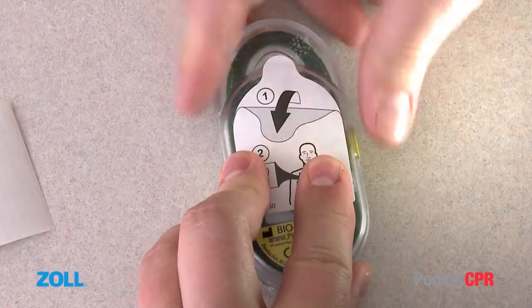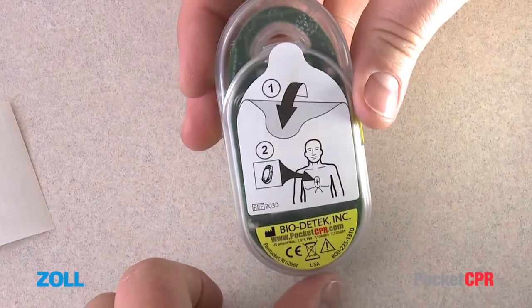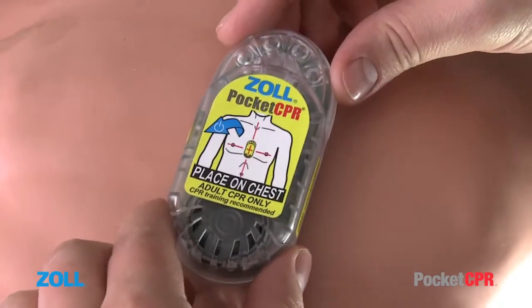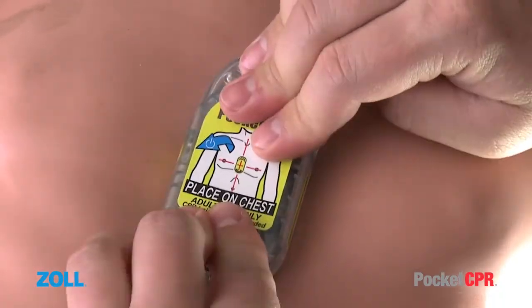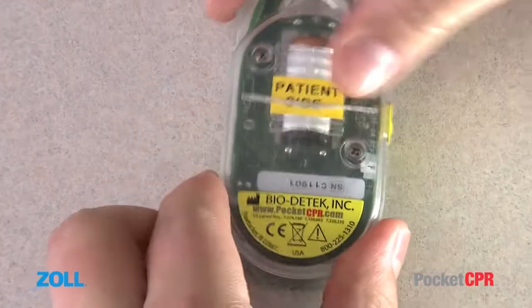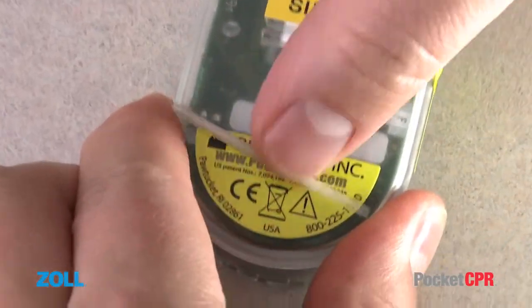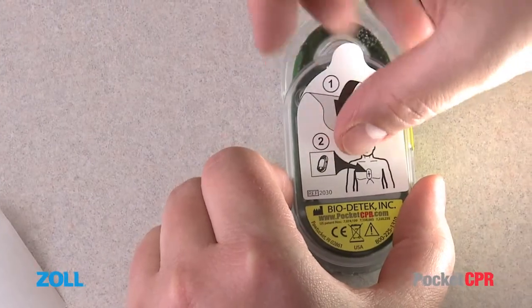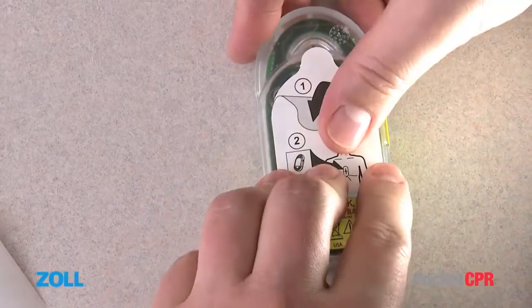When ready to apply the PocketCPR to a patient or mannequin, remove the label face by grasping at the top. This adhesive film can easily be removed from the PocketCPR by rolling it off in a single piece as shown here. Replace the rear adhesive label after each patient or as needed during training.